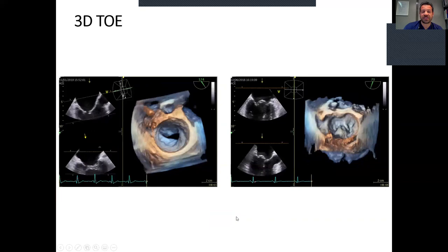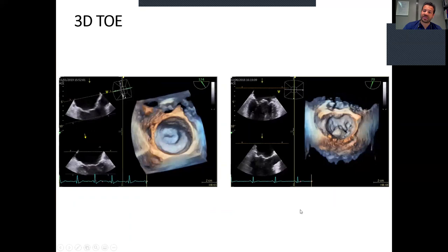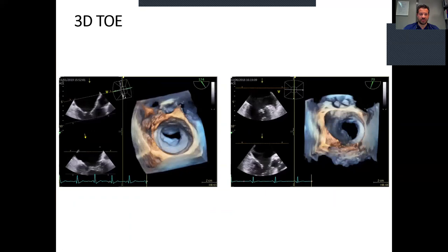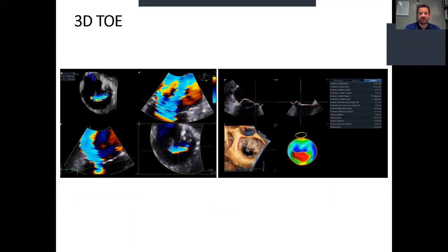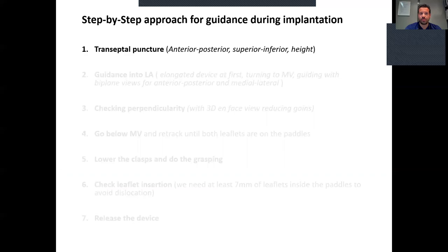We have to check the 3D and biplane views. Here we have two different patients: one on the left with functional mitral regurgitation where there is no pathology of the leaflets, and on the right a patient with prolapse of the P2 part of the posterior leaflet. It is important to show these images to the interventionist so he understands where to implant the Pascal. We can also use MVQ analysis to demonstrate the prolapse and vena contracta area to measure the regurgitant orifice area by 3D.